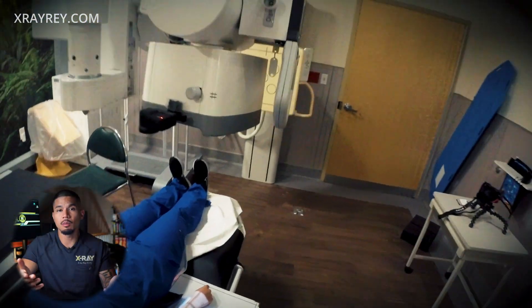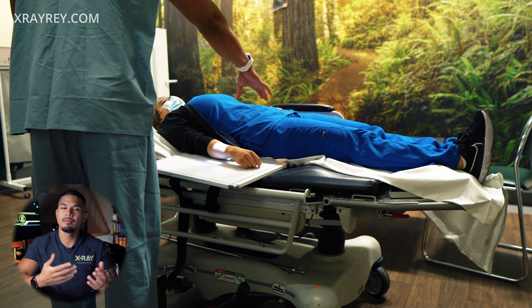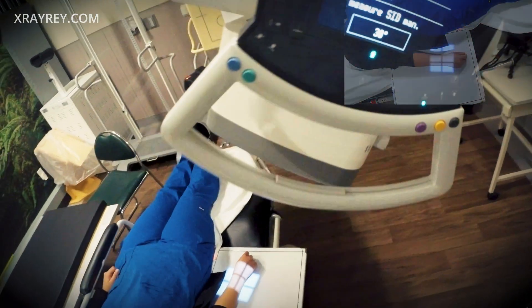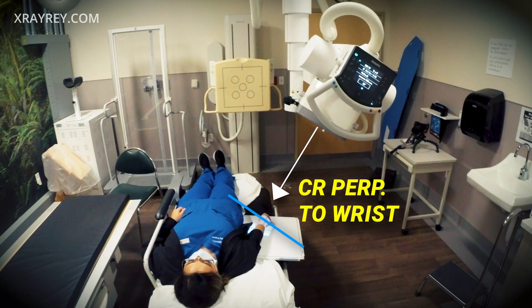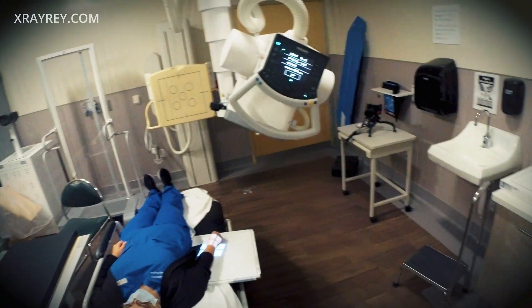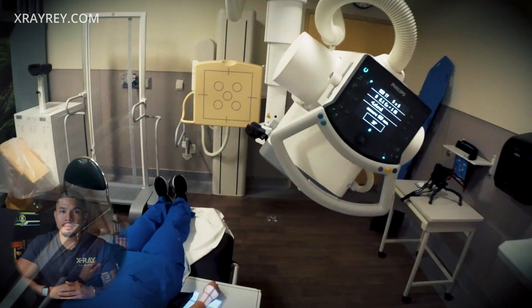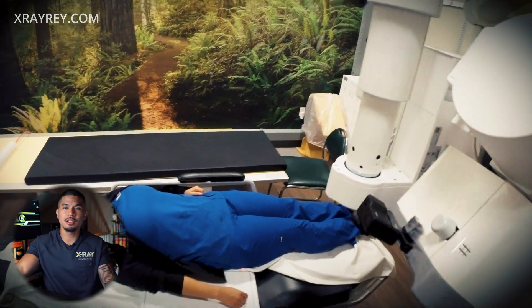I then asked if she's able to rotate her arm into a PA. Unfortunately she cannot. No worries — I simply match the angle of the wrist with my tube. Hold very still. Now for the cross-table lateral — this should be easy, right? Just place the image receptor on the other side of the wrist and shoot.